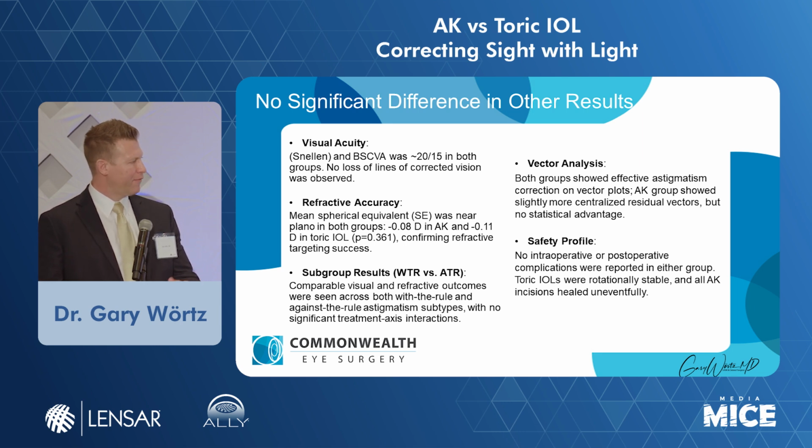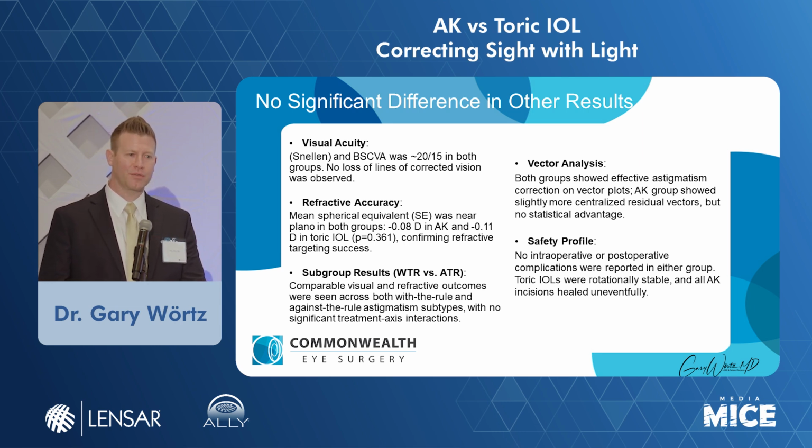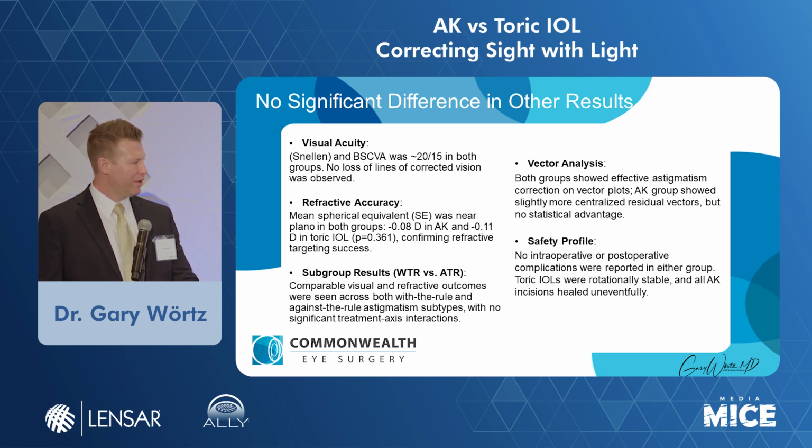That was actually a little bit frustrating. I was kind of wanting to know the actual answer, what's better, but it turns out that with this laser and with good technology, you can get great results. We also did vector analysis and showed good grouping with no statistical advantage in either group. And we know this is safe. We know that both of these treatments are safe, so we're really, really happy about that.